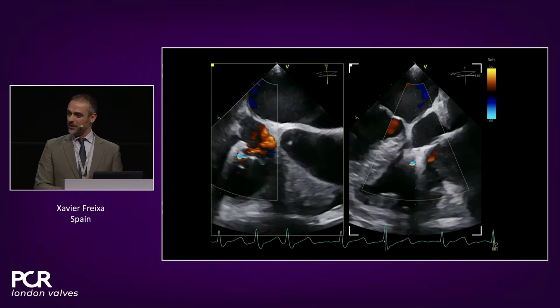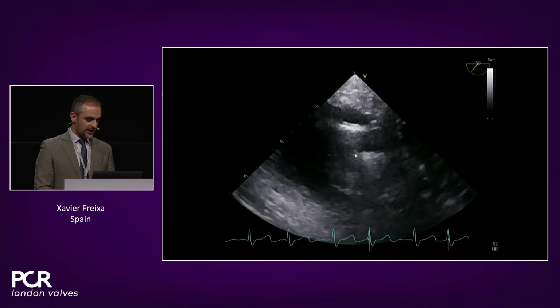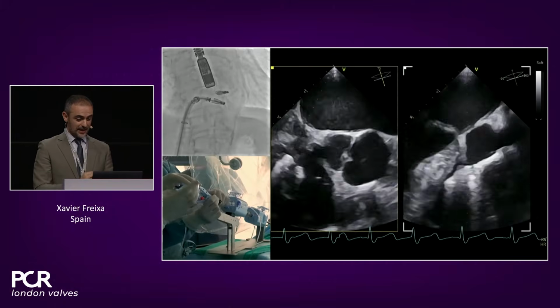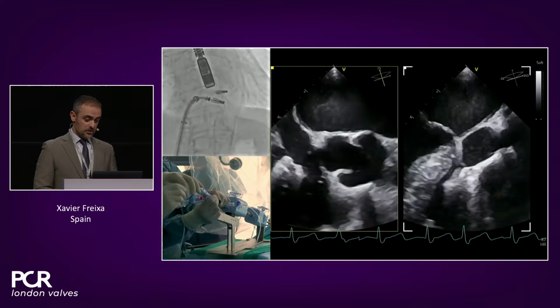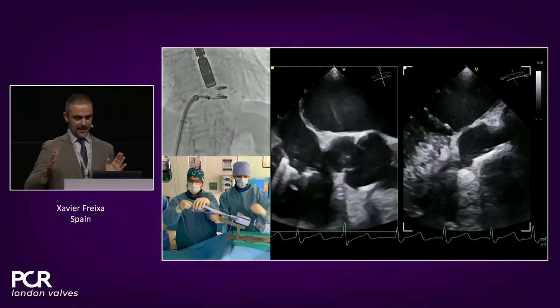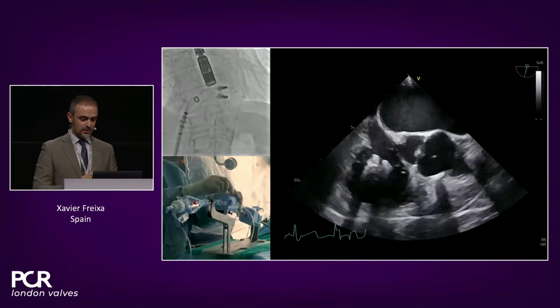So what do we do, are we treating color or are we treating anatomy? In this case, you checked in the transgastric that we decide to treat anatomy. We had huge tissue inside. We thought that would be the best thing, the approach was good. So we decided that was better than before. So we release it. Again, axial alignment is good because when we release it, it's not moving at all.